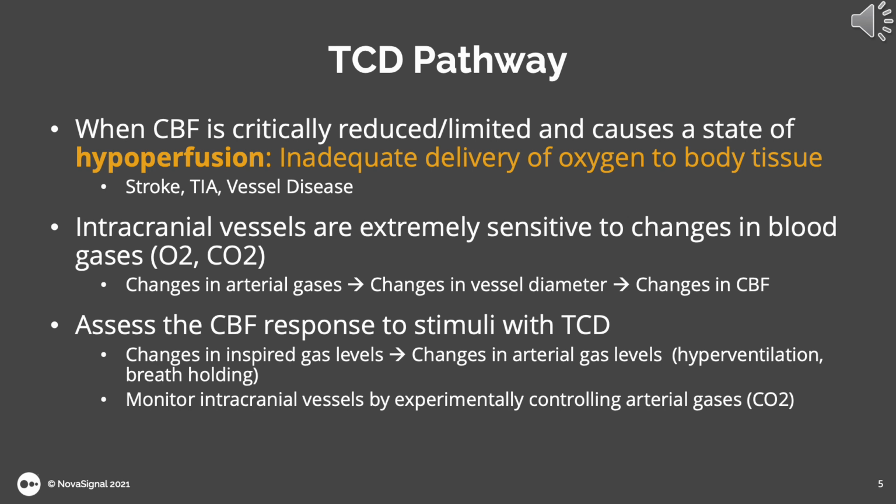TCD pathway. When cerebral blood flow is critically reduced and causes a state of hypoperfusion, which is inadequate delivery of oxygen to body tissue caused by occurrences such as strokes or TIAs and vessel disease like moyamoya. Intracranial vessels are extremely sensitive to changes in blood gases, such as CO2. Changes in arterial gases lead to changes in vessel diameter, which leads to changes in cerebral blood flow. So we use TCD to help assess the cerebral blood flow response to this stimuli.